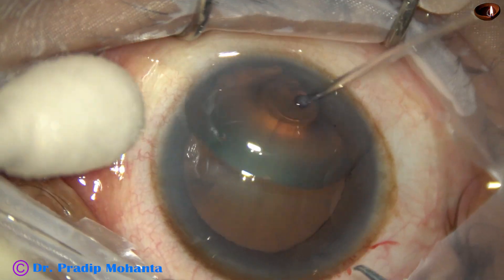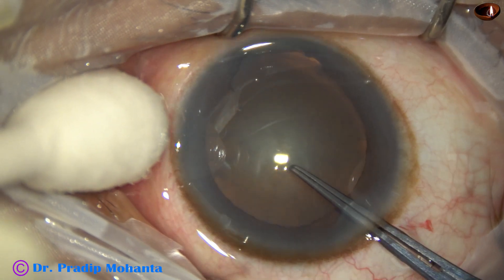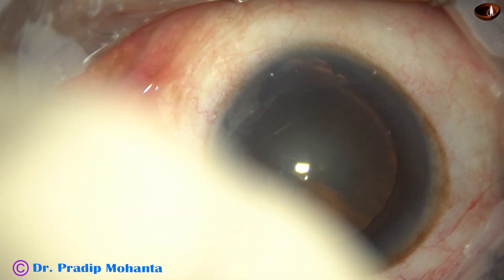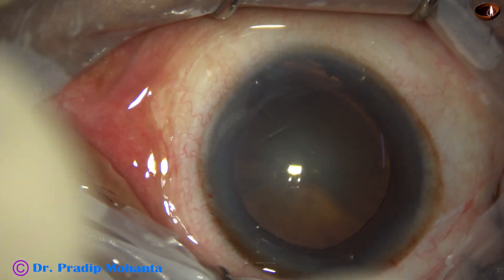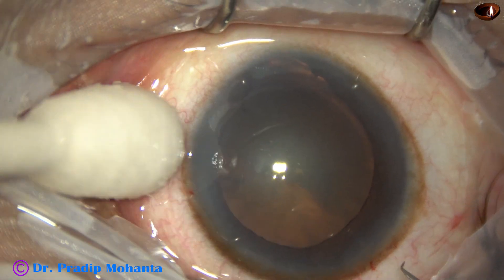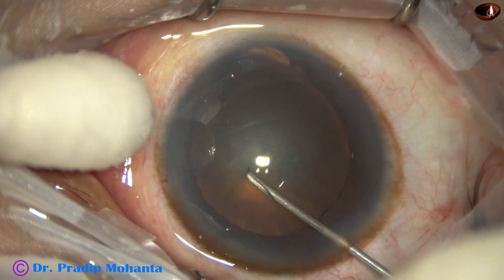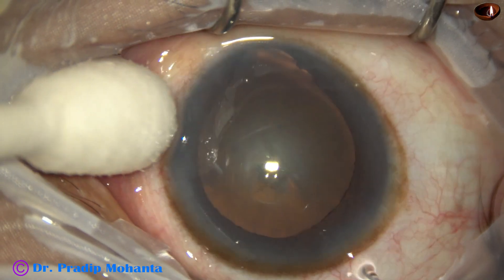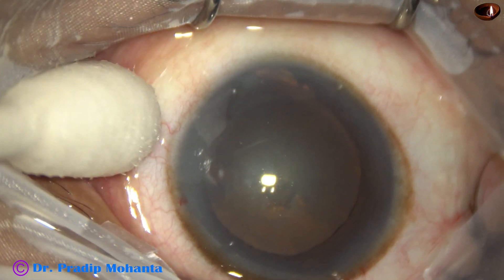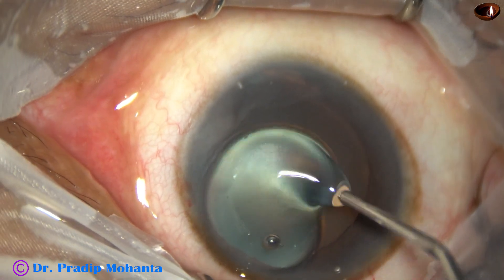As I try to do the capsulorrhexis, the tip of the utrata forceps does not want to pierce — there is wrinkling of the capsule. In such cases, we should take a sharp needle and pierce the capsule and raise the capsular tag. I pierce the capsule with a sharp 26-gauge bent needle.